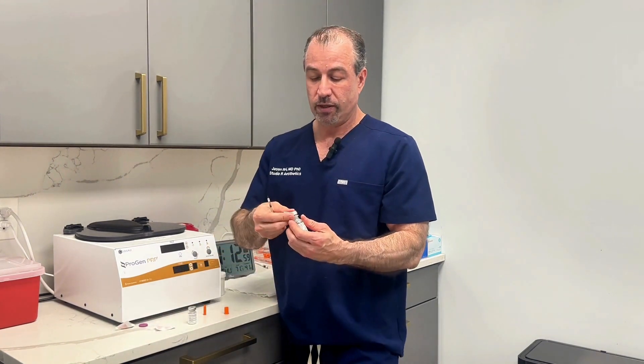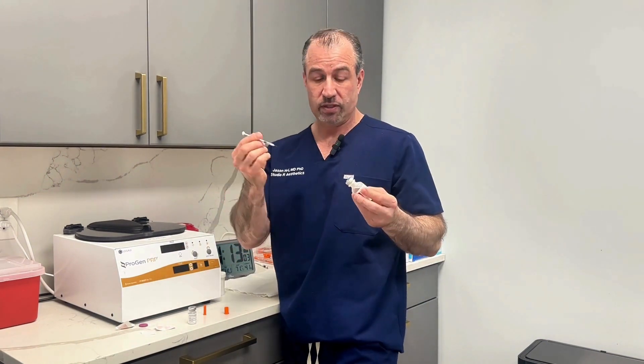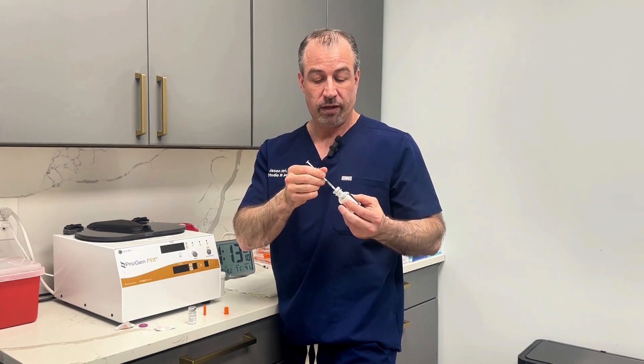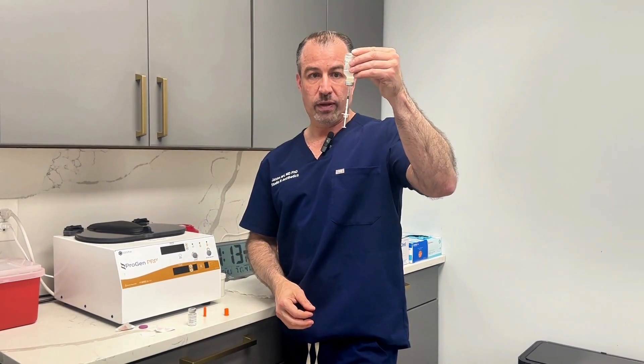Pop the cap off the semaglutide. You're going to do a little alcohol on the top of the semaglutide. Everything's sterile, single use. If you bend the needle or drop it, you're going to get rid of it and use a different one. Then you're going to put the needle right in the center of the gray, flip it upside down, and if you let go of the needle, it'll hold onto the needle, so you don't have to worry about the needle falling out.